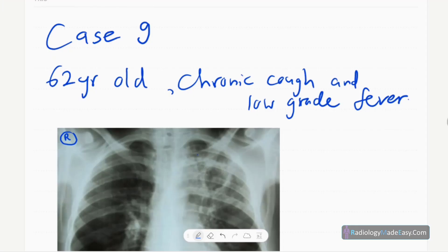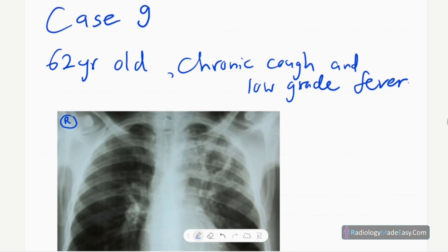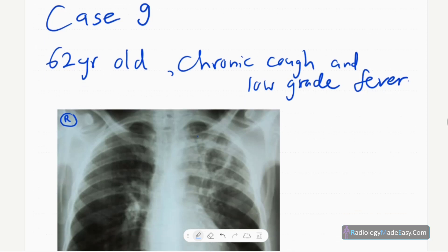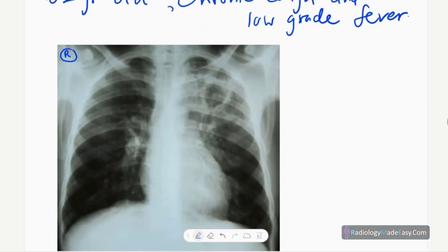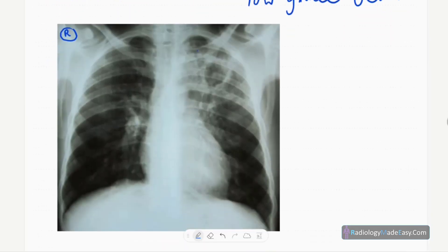Hello everyone, this is case number nine of the RS series in radiology. Our patient today is a 62-year-old male who presented with chronic cough and low-grade fever. This is the frontal chest radiograph of this patient.